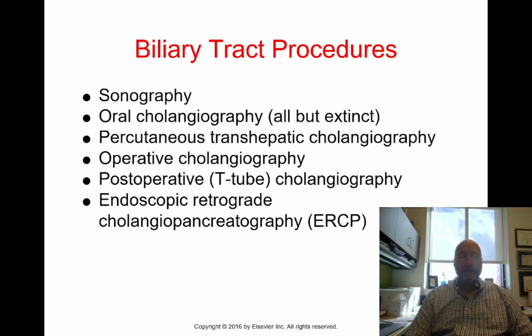I don't know of any doctor's office or hospital that does oral cholangiography, but I'm going to touch on it anyway and just tell you what the limitations are for oral cholangiography and, from a historical standpoint, why we don't do it all that much anymore. We're going to talk about percutaneous transhepatic cholangiography, operative cholangiography. If you're a staff technologist, providing you have dedicated surgical techs, the most common that you would do would be a T-tube cholangiogram.